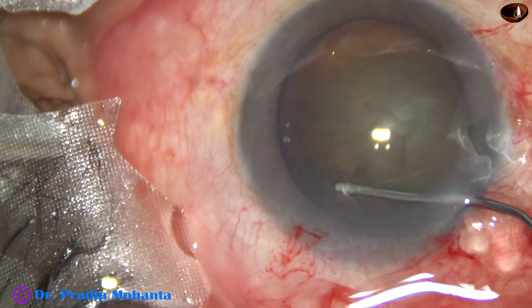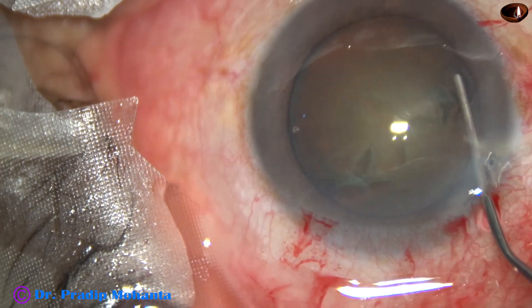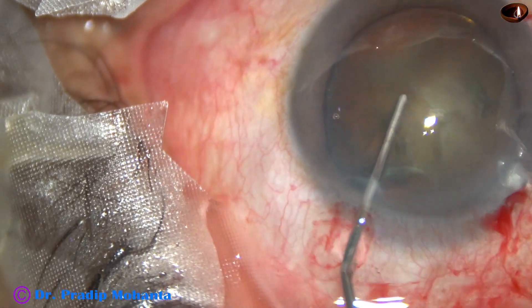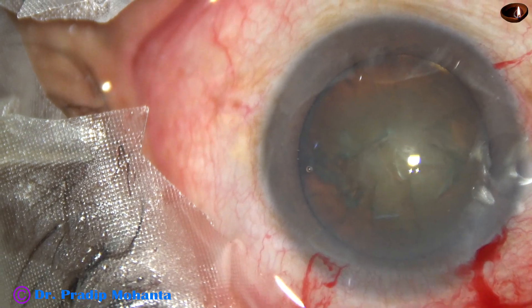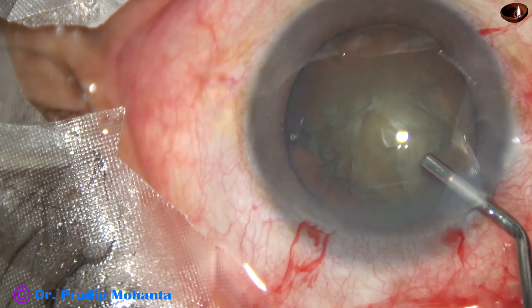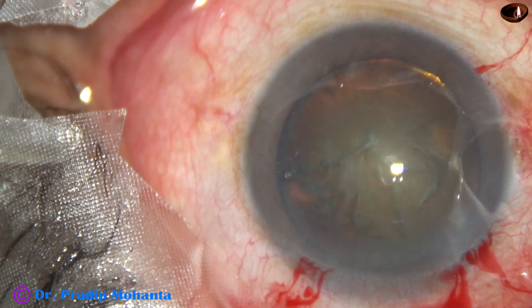Now hydrodissection is done. We have seen the fluid wave went from this side to the other side. The nucleus is tapped and rotated.